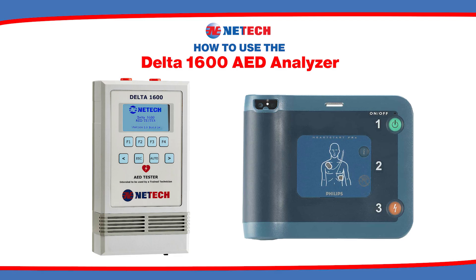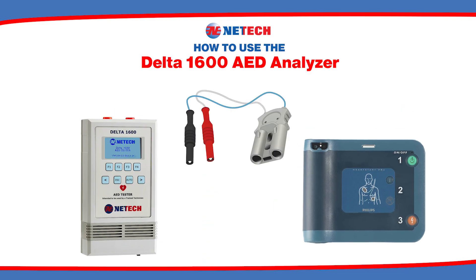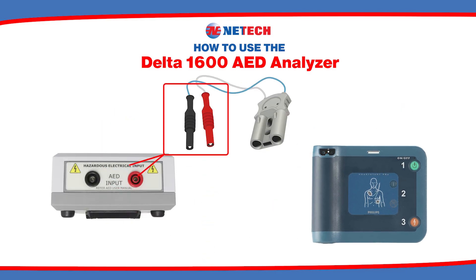To begin, power on both the AED and the Delta 1600. Connect the interface cable from the AED to the input on the top of the AED tester.